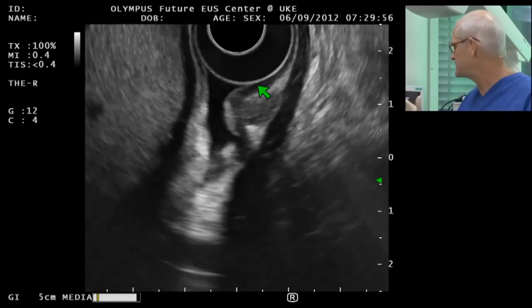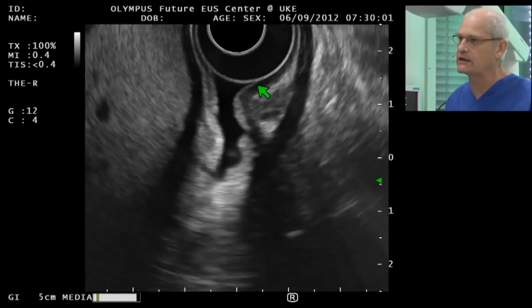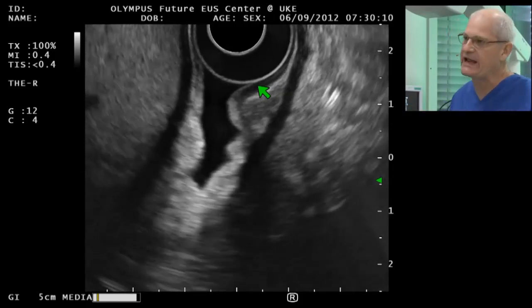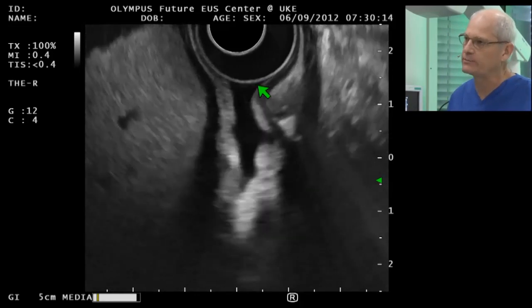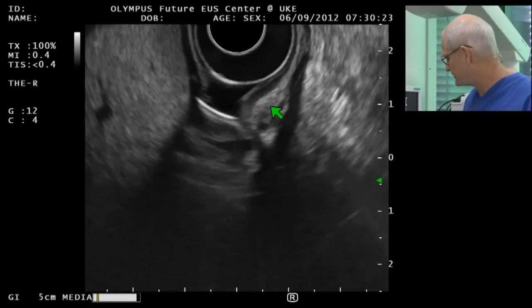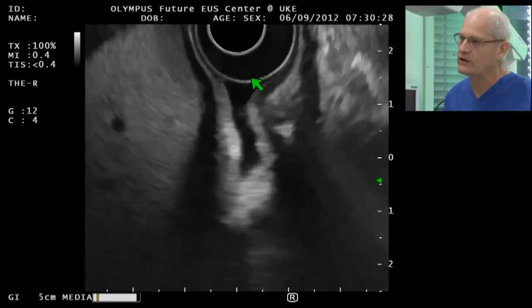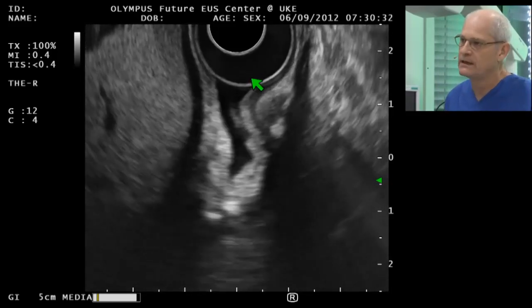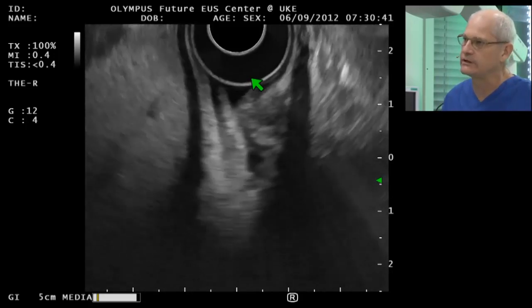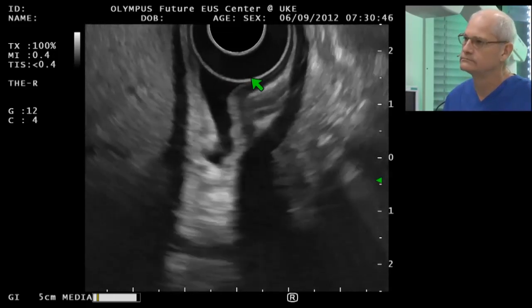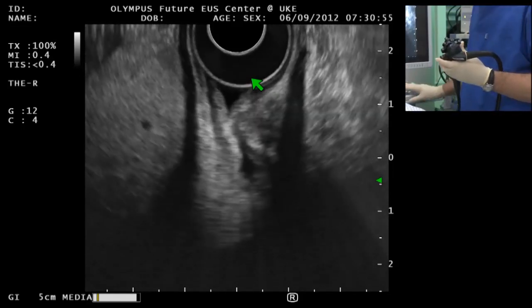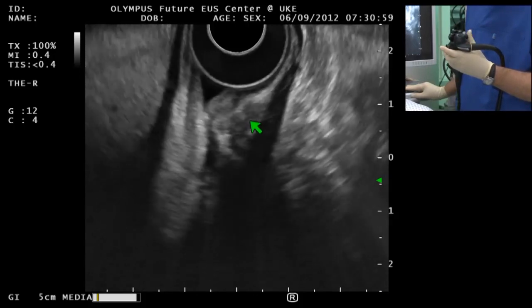The Future EUS Center has some very nice components. We've switched to an enhanced image mode — this is an enhanced resolution mode, and you can appreciate the improved resolution. Maybe there's a little bit of a cystic area here. This instrument also has tissue harmonics and elastography as part of its functions, and it runs both a radial and a linear array echoendoscope, making it a multifunctional instrument. I'm still looking for ductal structures in here, and maybe there are some.